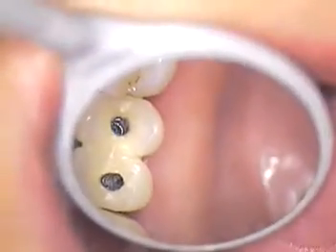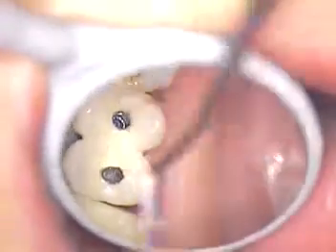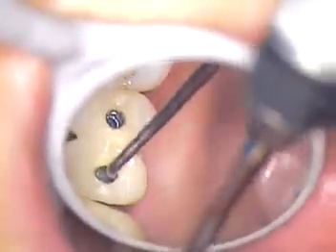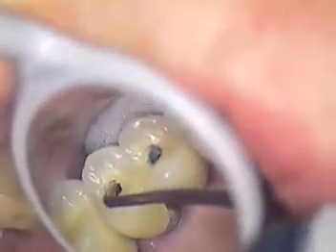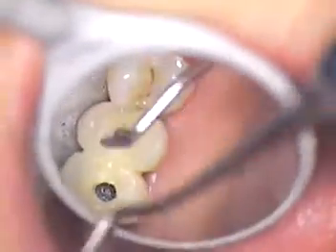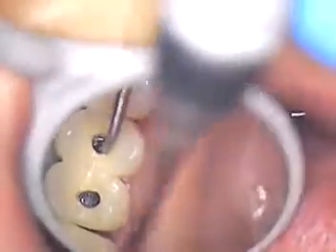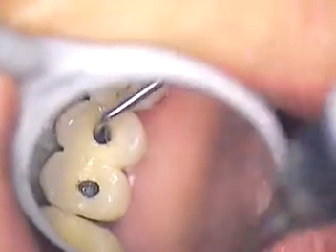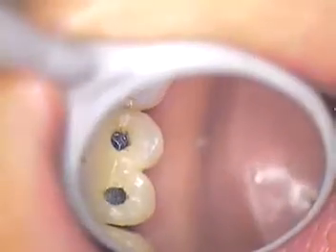Let's see if it can be reached that far down — yeah, it's turning, all the way down. Perfect. That's good. So as we get it to turn, they should be coming more and more loose. Let's try it.